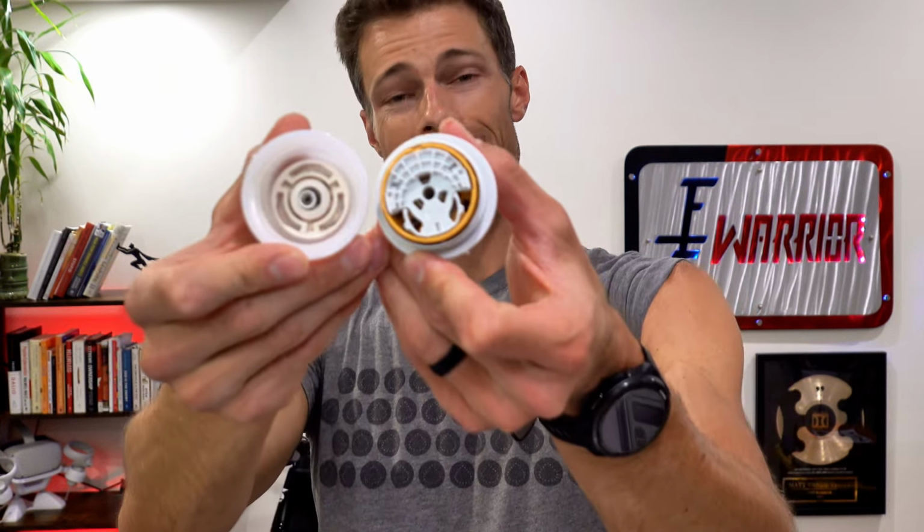So what I did, now that we're here, I went ahead and pushed down. That's literally it. It was together, I unscrewed it, I put it on my skin where I wanted it, and I pushed. I applied pressure. Honestly, the insertion, totally fine, zero pain. I was a baby there for a second. I kind of jumped. I didn't feel anything though. But as soon as I moved my arm, I think my muscle kind of touched where the needle was, and the needle comes back out, so now it's just the wire, and now there's no pain. So we're good.